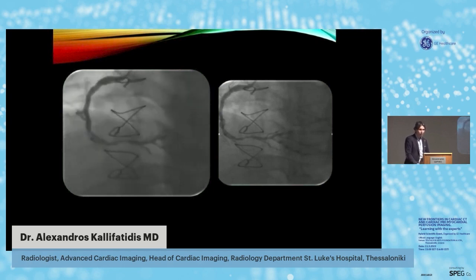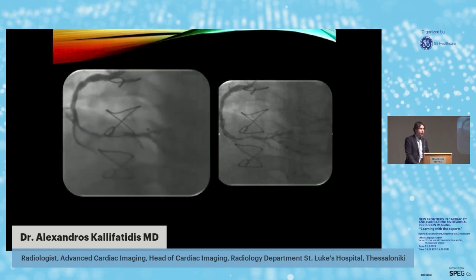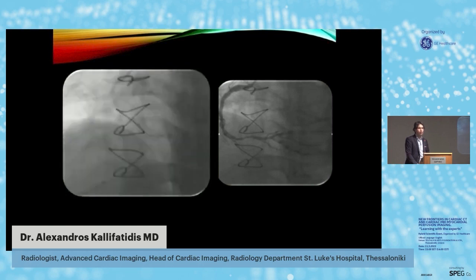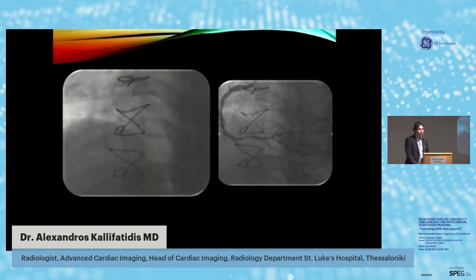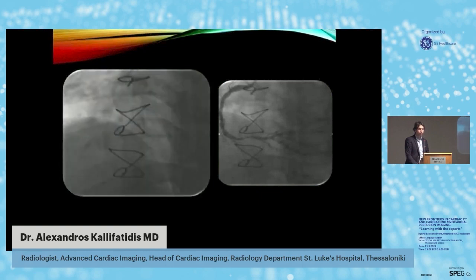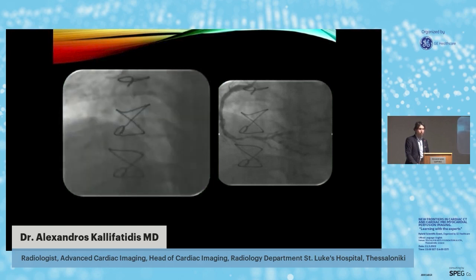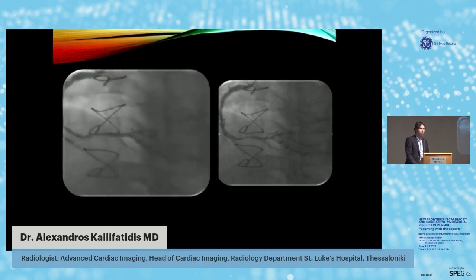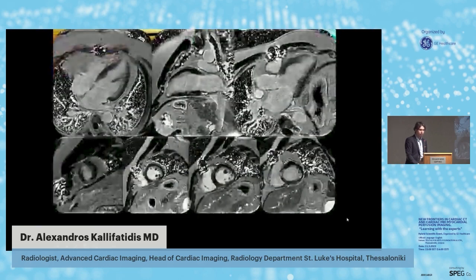Okay, perfect. So a lot of innovation, and you think, Kostas, that in the next 1, 2, 3 years, this technique will be much more globally available? How do you see the progression? I think our experience showed that, for example, with the pre-bolus or the dual bolus approach, it requires some additional efforts to change the clinical protocol in order to adapt to that. But with the dual sequence approach, I strongly believe that this will change. This will be a game changer on the way that we currently diagnose the ischemic heart, for sure.